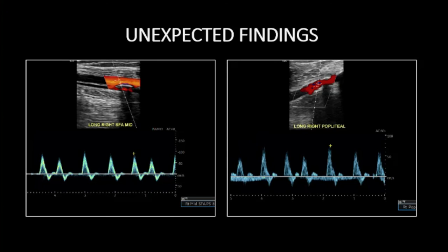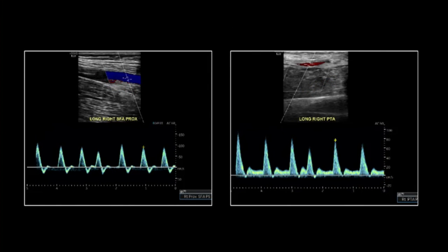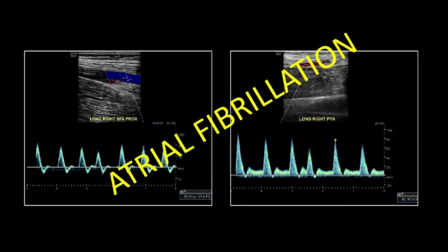I encourage you to keep alert for unexpected non-arterial findings on spectral doppler imaging. This was an extremity arterial duplex exam with clinical indication of claudication. Notice the irregularly irregular intervals between each waveform at each interrogated arterial segment — no one segment displays a similar waveform interval. This is atrial fibrillation, which I confirmed when I called in the finding. The patient was known to have AFib but was thought to be back in sinus rhythm, so the finding on this exam prompted additional evaluation and management.